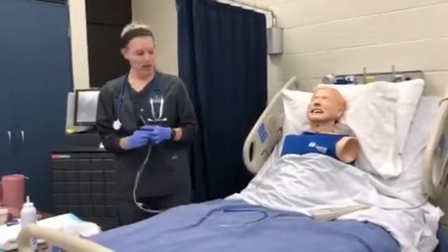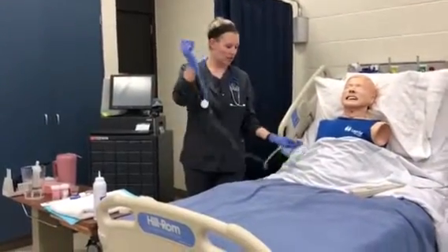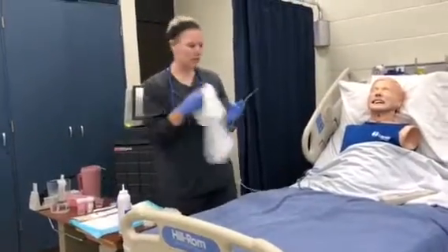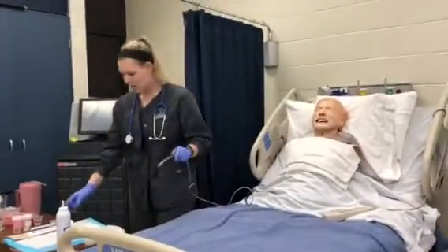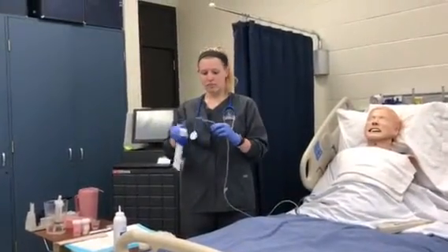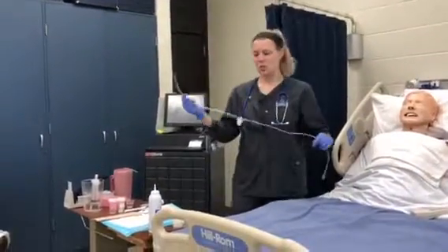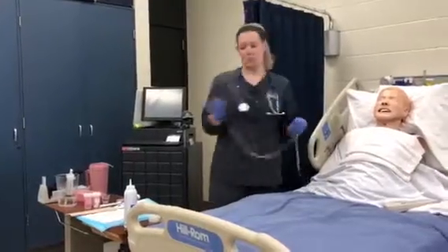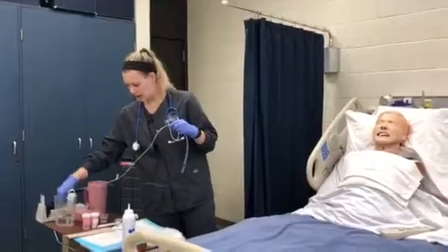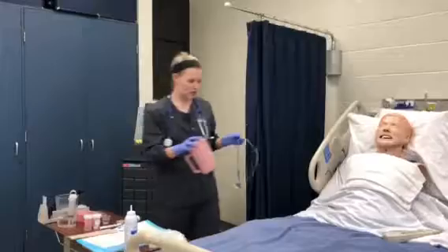Okay. And this might be hooked to suction, it might be hooked to a tube feed. It just depends. So now I'm going to put this towel over the patient just because it can get a little messy. And I'm going to put some lubricant on my NG tube, but for this demonstration, I'm just going to use some water just because I don't want to put lube in the mannequin. So we just get that all lubed up. We're going to need this water too.